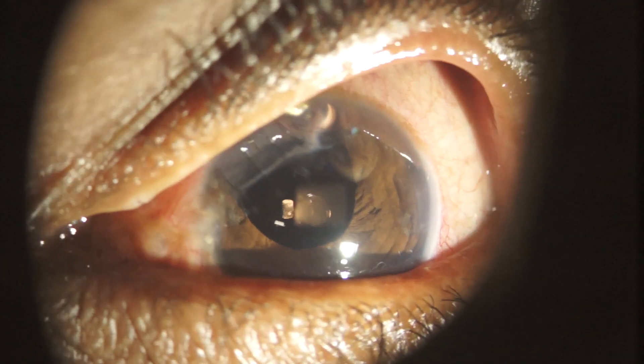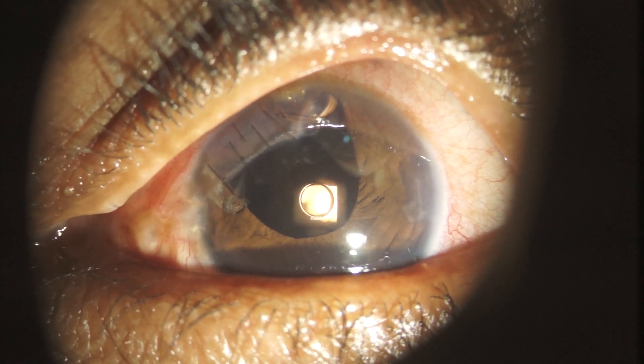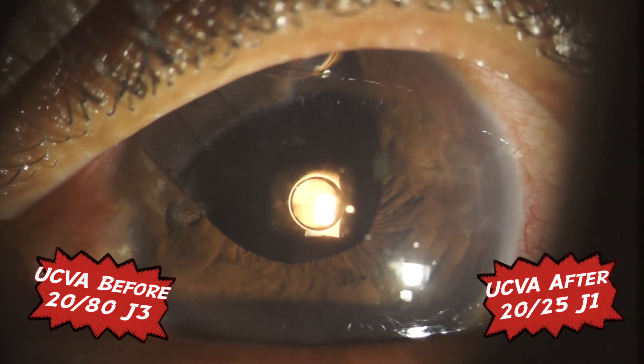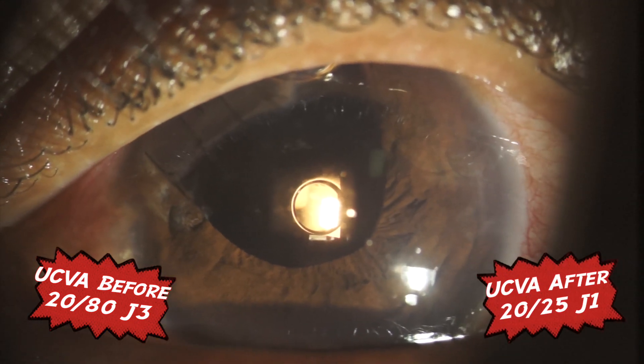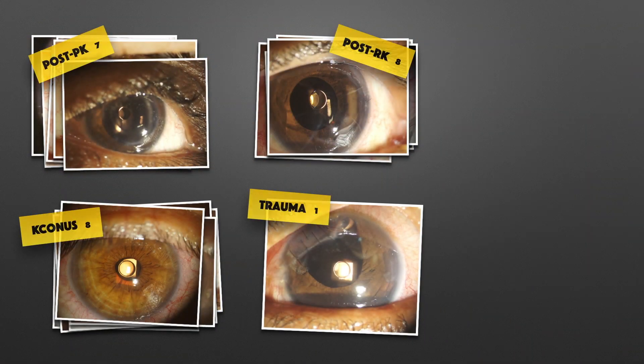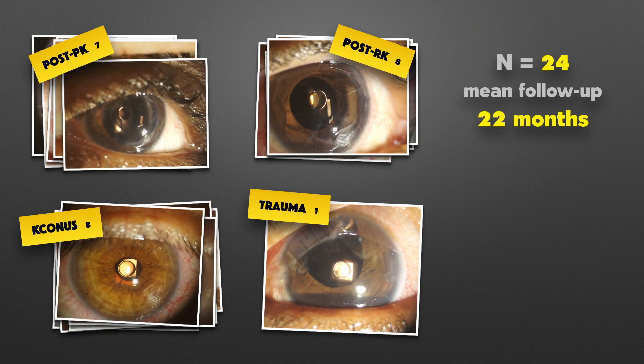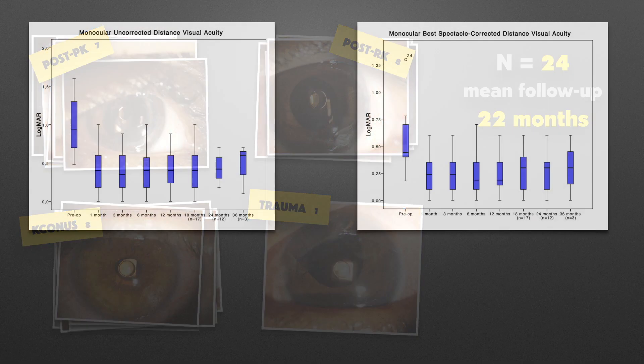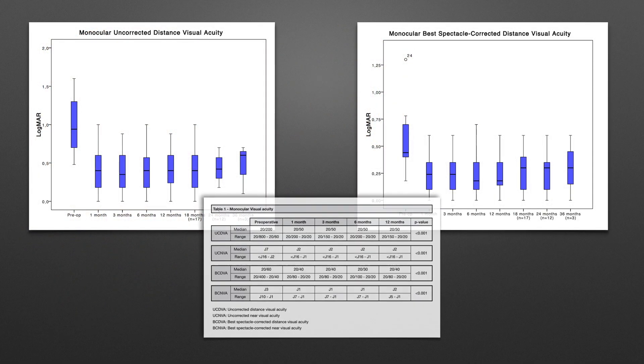Again, we see excellent centration and a significant improvement in visual acuity, with reduction of dysphotopic symptoms. In our study, we implanted the device in 24 eyes, mean follow-up was 22 months. These are the results for uncorrected and best corrected visual acuity.